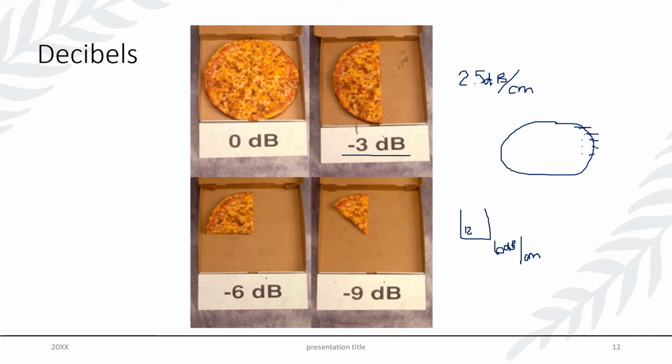So if you know that, trying to reduce the depth that you're scanning is going to reduce the attenuation, which will leave you more remaining beam to produce an image. Some of the ways that we can do that is if I have, say, a kidney, and going through the anterior part of the patient, I would have to go through a significant amount of tissue.